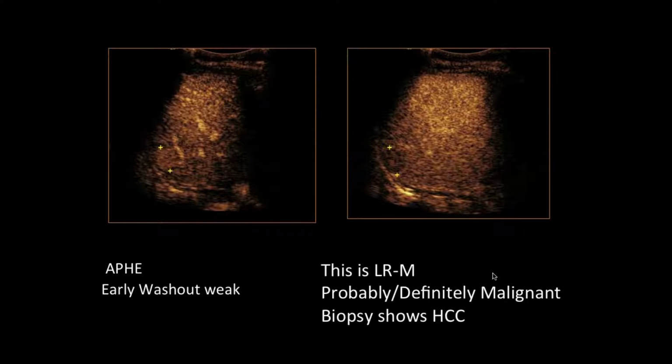And I show this case to make the important point that this LRM category is invaluable to make us suspicious of the possibility of the presence of a non-hepatocellular malignancy. However, some HCC will come into the LRM category as well, but will be managed well because we're recommending biopsy for the confirmation of their diagnosis.